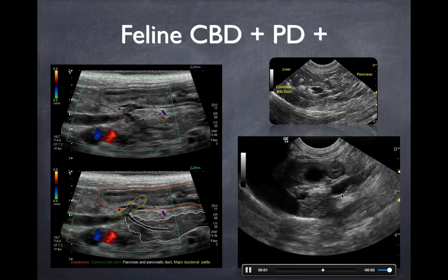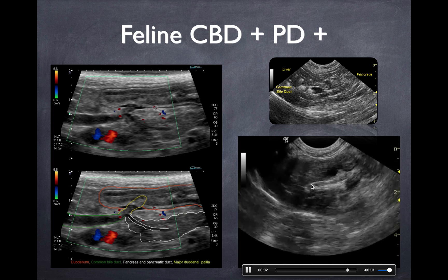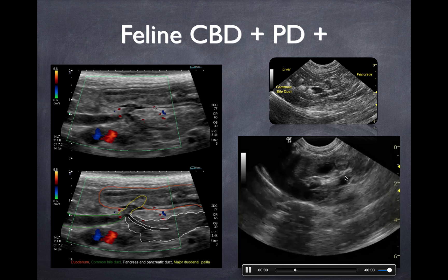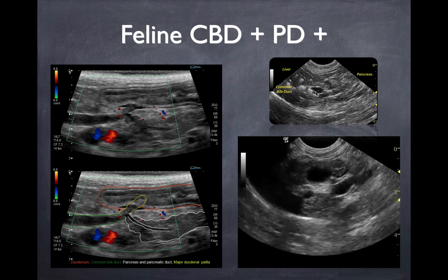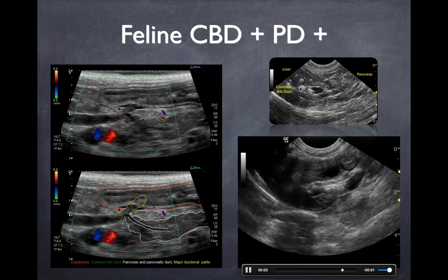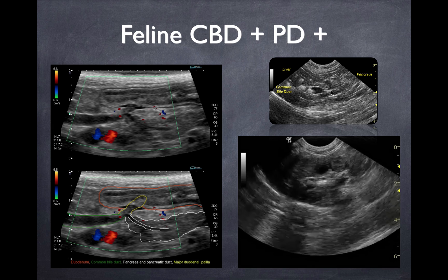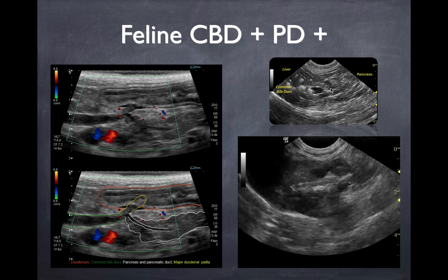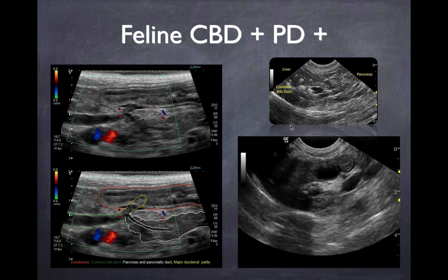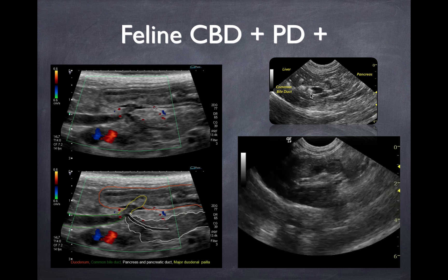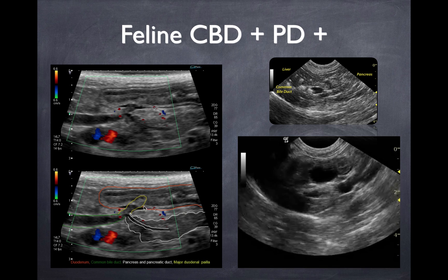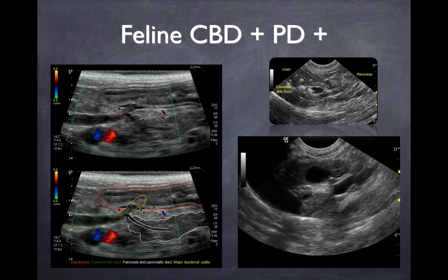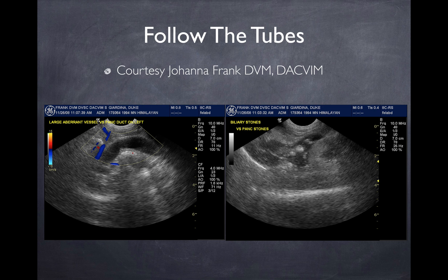Here is another cat where the portal vein comes in, the common bile duct comes in, there's the gallbladder folded over on itself, and it drives into the duodenal papilla. Often in cats as well as dogs you'll see the portal vein here and a dilated common bile duct beside it — you can see the difference between a normal one and a dilated one. This one has a bunch of calculi in it, and in another view there's a calculus sitting in the area of the duodenal papilla entering into the duodenum. You can evaluate these calculi as they move down from the lobar parenchyma into the common bile duct and then lodge. You'll also get strictures of the duodenal papilla from stone passage, infection, inflammation, or tumors, and often pancreatic duct dilation as well when you have pancreatic or biliary calculi.